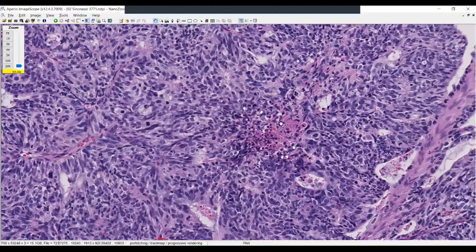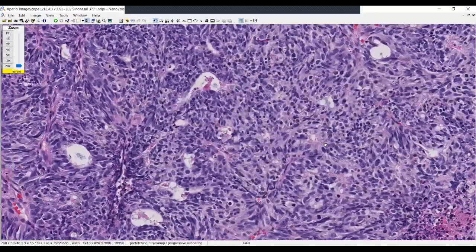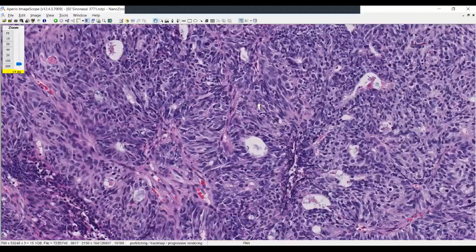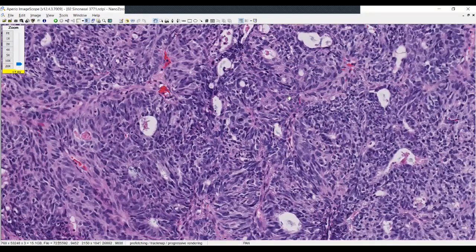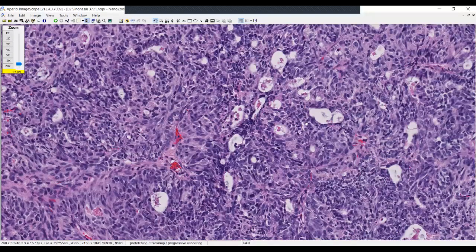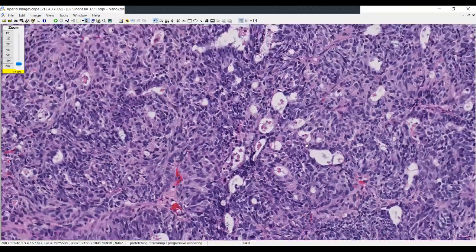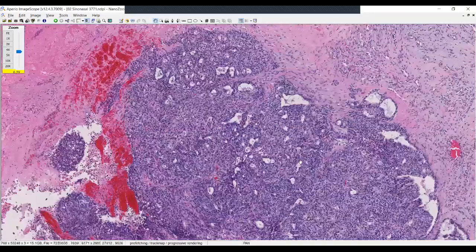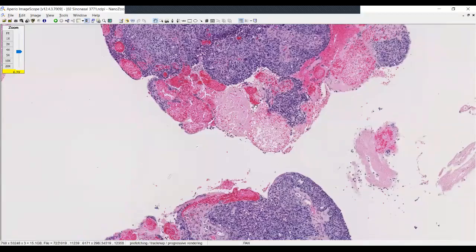Furthermore, areas of comedonecrosis like this, so in other words, genuine comedonecrosis that is present deep within the lesion, this is not something that is surface associated, this is genuinely a comedonecrosis within the tumor. Multiple mitotic figures are usually quite easy to identify, and in fact, there is not really a good number that you're able to use in order to stratify. I tried to do this in a study and it turned out that more than 25 generally were seen in carcinoma versus those that were not. And so I don't sit there and count them, but just be aware that you can have multiple mitotic figures.